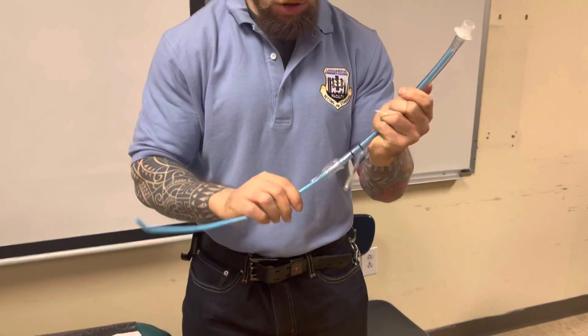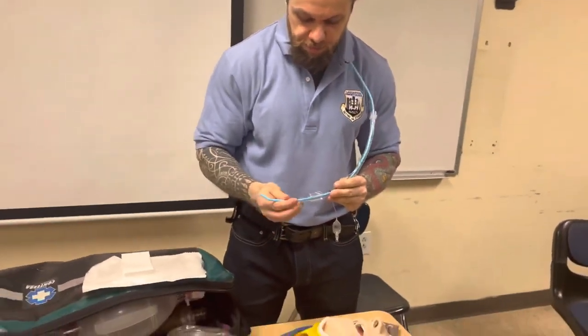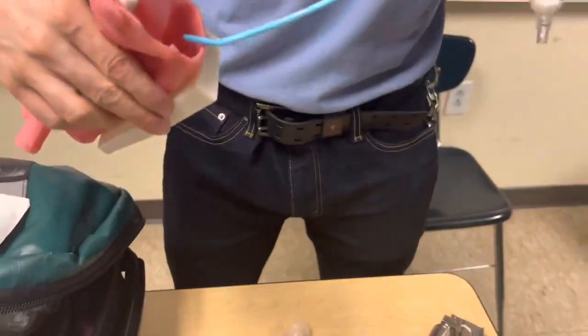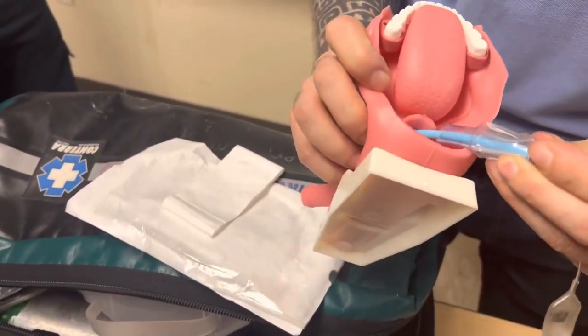One trick that you want to do is this. Can you bring me that mannequin cutout over there? You see how the bevel of the tube is pointed sideways? So when I'm here, the tendency of this bevel is to get caught right there when I'm putting it in.